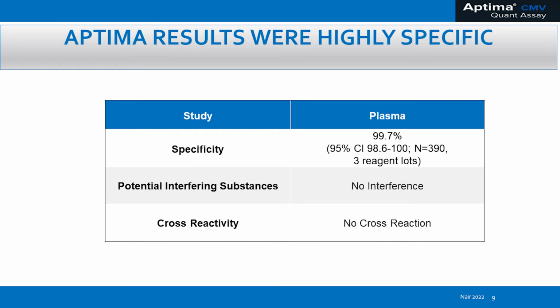Now, one thing to note is these results are with the WHO standards, while those presented by Dr. Lima as well as Dr. Harrington were with dilutions of the exact panel. And it's great to see such good agreement in LOD and LOQ at different sites with different panels, and yet very similar results. This assay also has very good specificity.